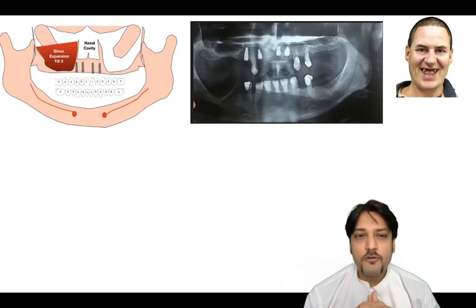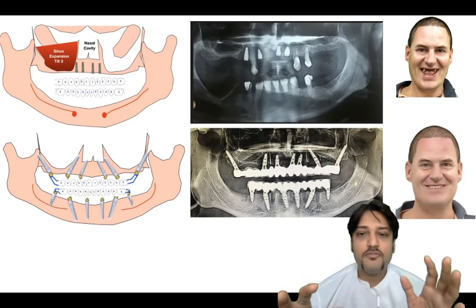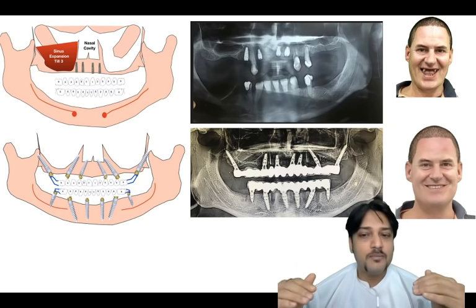Now what was planned? We decided we will go ahead with a full mouth definitely, but we need to reinforce your upper and lower jaw. So what was decided? To go ahead with the placement of a few implants in such a way that proper forces will be distributed on all the implants everywhere.